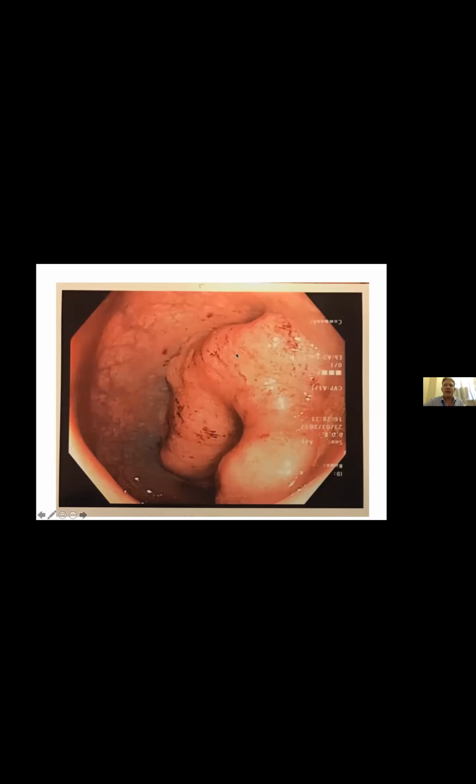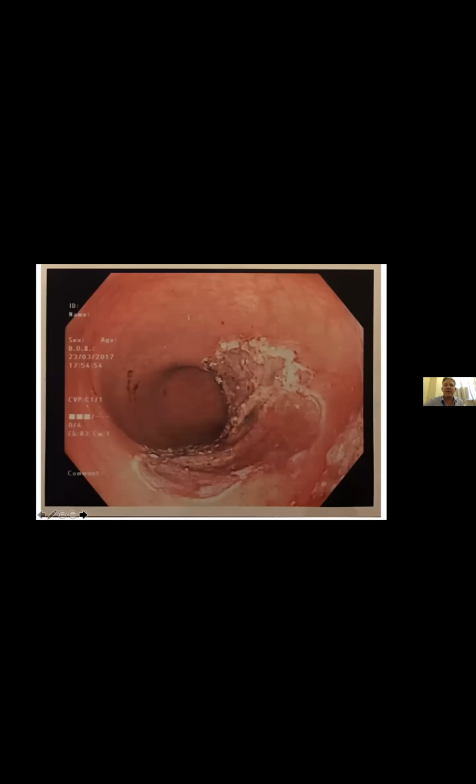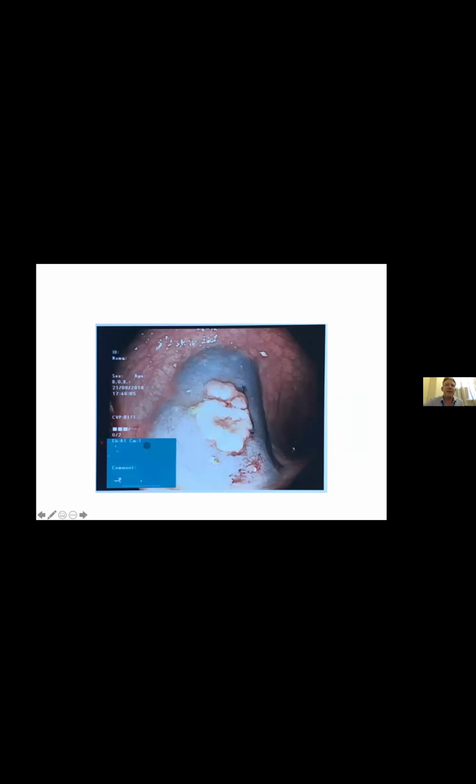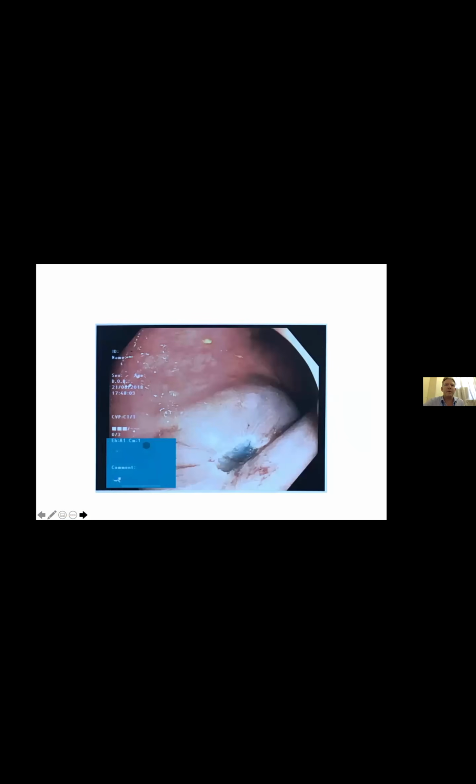We can do some quite substantial polyps. So this was referred as a cancer, but when we reviewed the MRI, we were fairly certain it wasn't, and that's it at the end. A kind of intermediate polyp, a little bit concerning when you've got a depressed area in the center here, because that might be an area of invasion, but we've got a very, very nice lift on it. And so then you know that there's no invasion there. This was taken out because it was just 1.8 centimeters, I think, and we did a hot snare on that. It was in the rectum, came out very nicely.